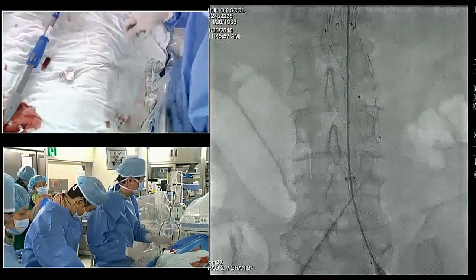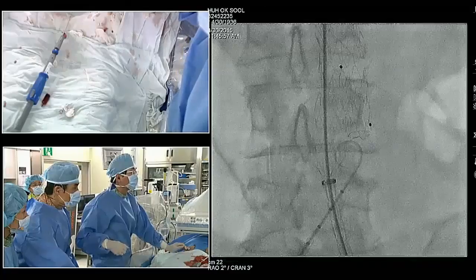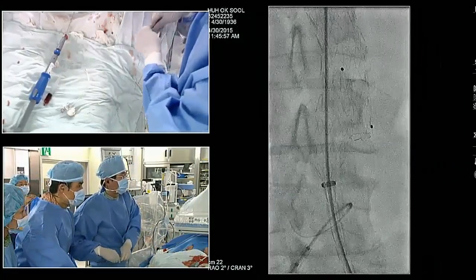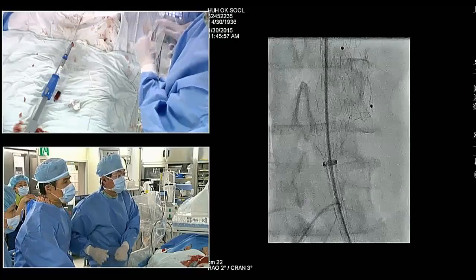This patient has calcification at the proximal part of the external iliac artery on the right side, and I wonder whether the iliac artery size is a little bit smaller, 6 or 7 millimeters. That's why they took the left side for the main body insertion.